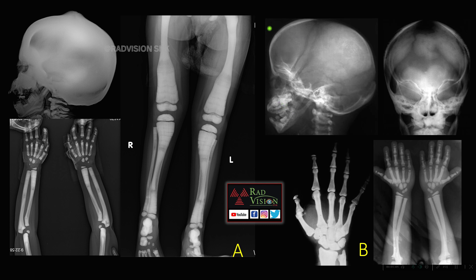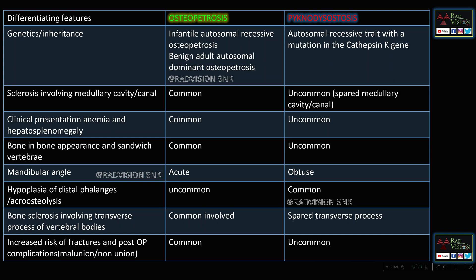Here you can see there is sclerosis of the skull vault, and there are patent fontanelles and patent sutures. There is acro-osteolysis and sclerosis of the bones, but there is no sclerosis of the medullary cavity or bone-in-bone appearance. This is a case of pyknodysostosis.